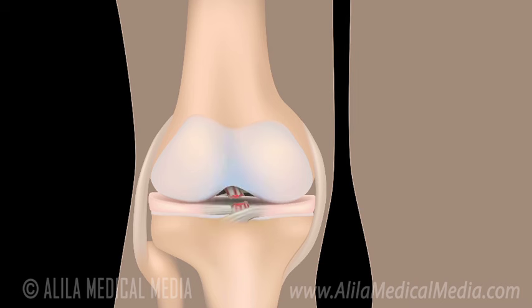ACL reconstruction surgery is performed to replace a severely damaged or completely torn ACL with a graft. The ACL is a thick band of tissue that connects the front end of the tibia to the rear end of the femur.